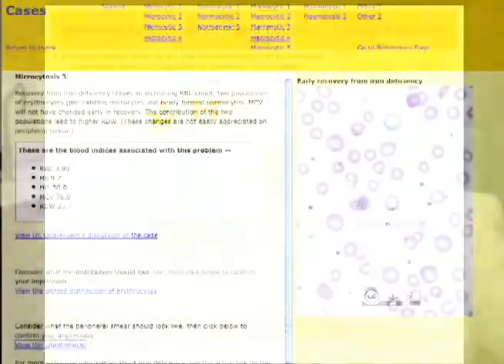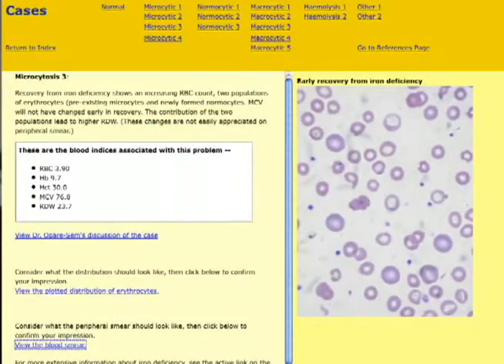So I intend to use this to bridge the gap between understanding and using the results of the automated blood count and its accessibility. It's very accessible now. As you click through, you will be able to match all the abnormalities in the clinical case presentation, the automated counting report, and then the smear. And once you put that together, you have a three-dimensional picture of what's going on.